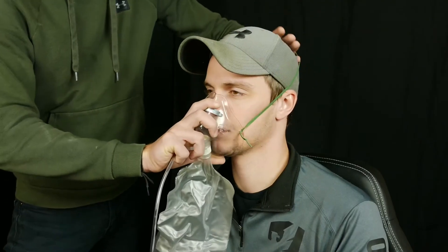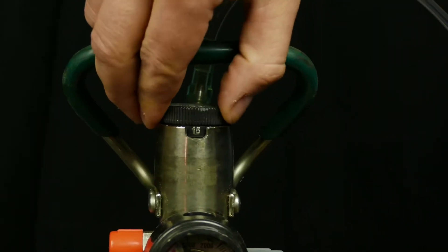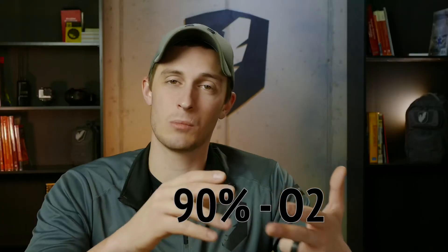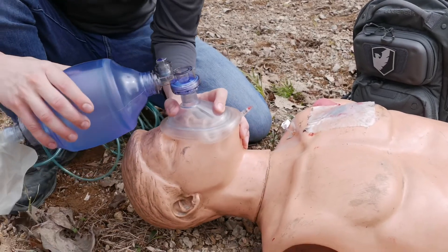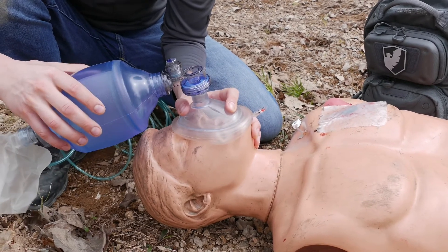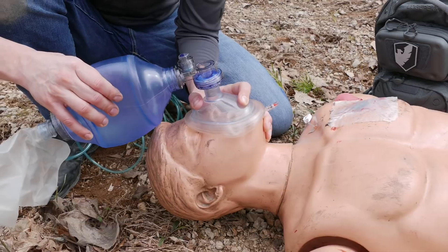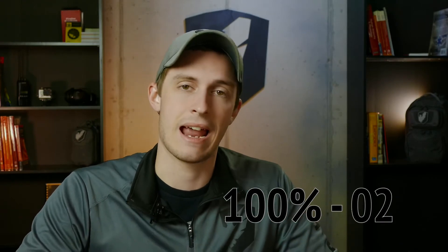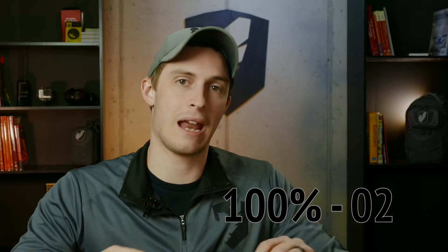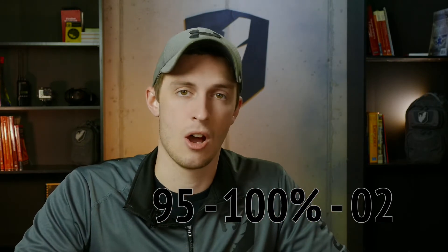A non-rebreather is our second route — a face mask that goes over the patient. We can set this at 15 liters a minute and deliver around 90% oxygen. The last would be a BVM, or bag valve mask. This is when we are actually ventilating for the patient, set at 15 liters a minute on supplemental oxygen, delivering somewhere close to 95 to 100% oxygen.